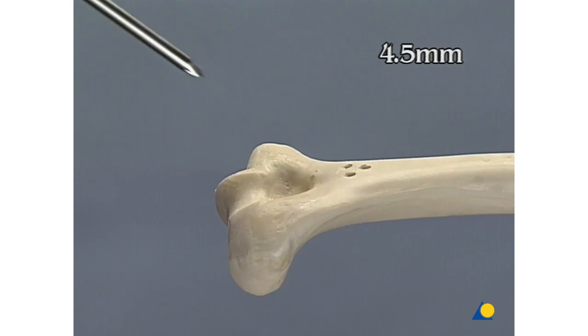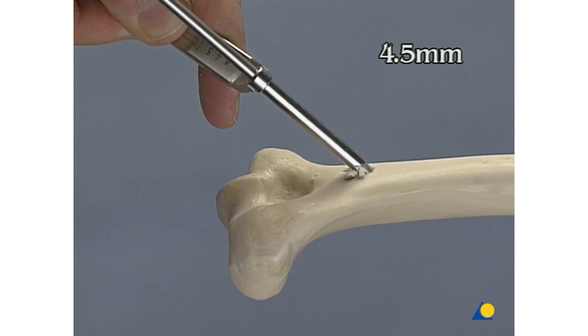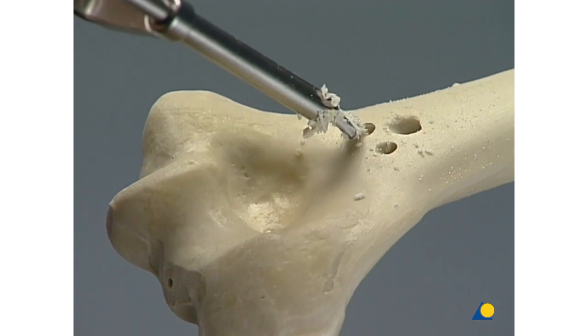Over-drill the holes with the 4.5 millimeter drill bit using the 4.5 millimeter drill sleeve. Once again, do not drill through the far cortex.